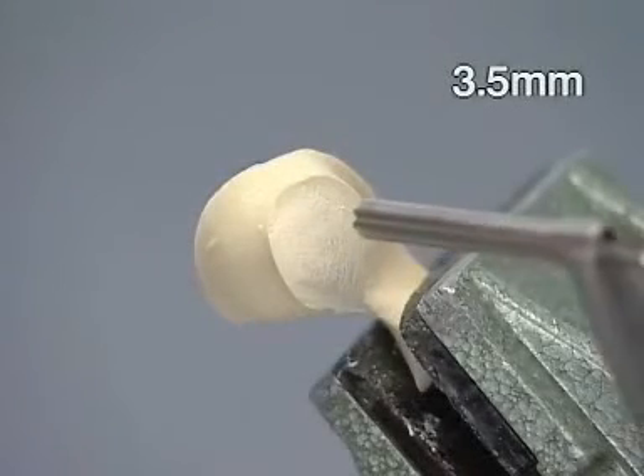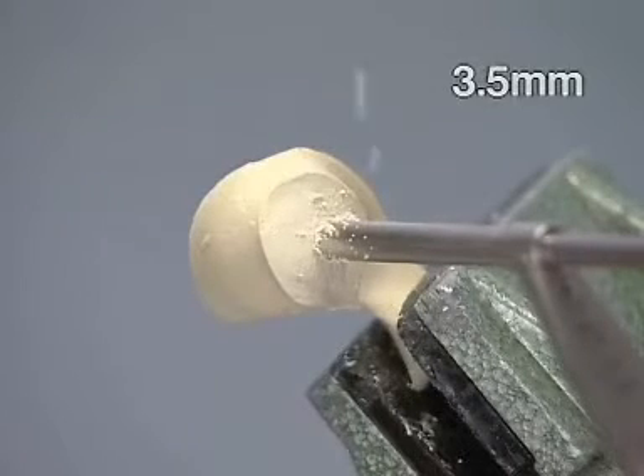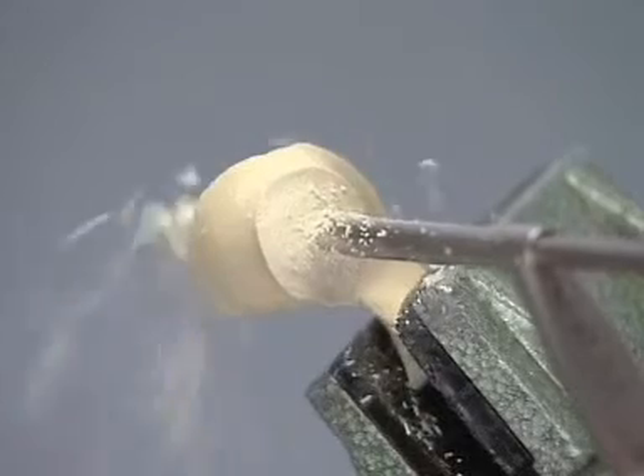An alternative method is to drill this hole from the inside out. When this is done, the glide hole is drilled from the center of the condyle, exiting the bone just distal and cranial to the lateral epicondyle.